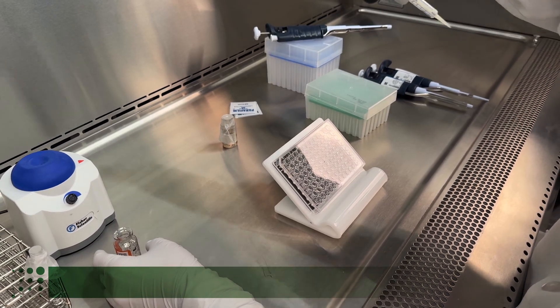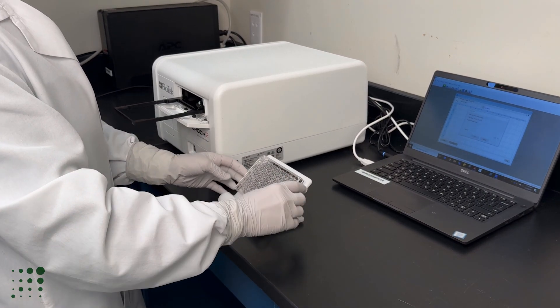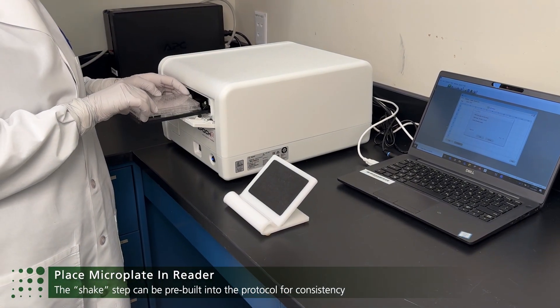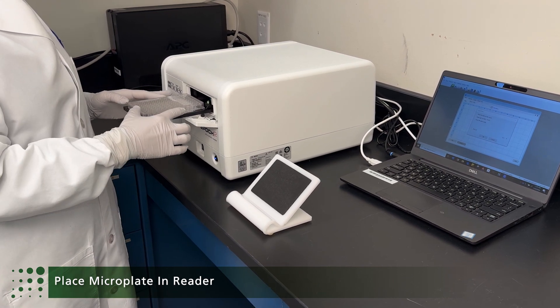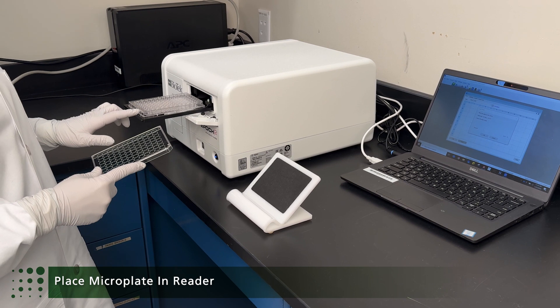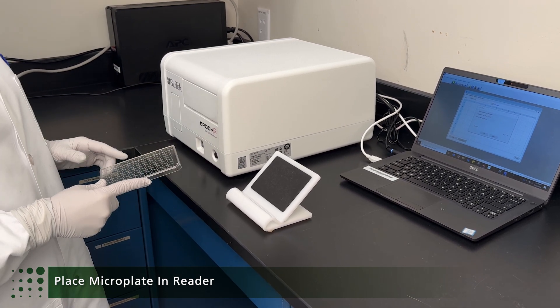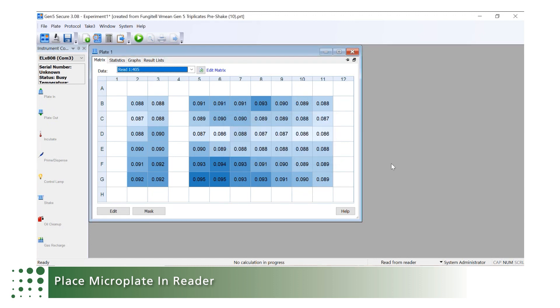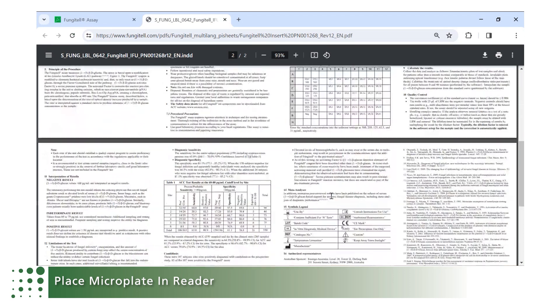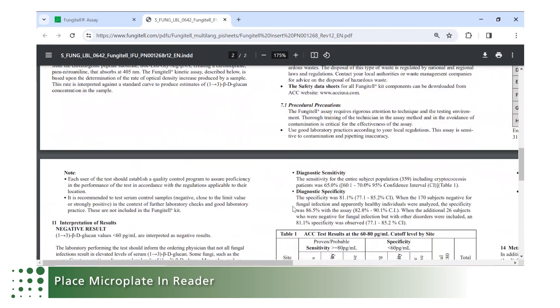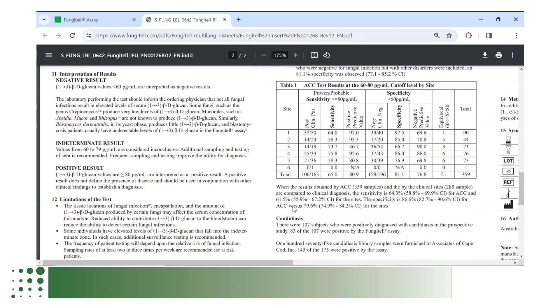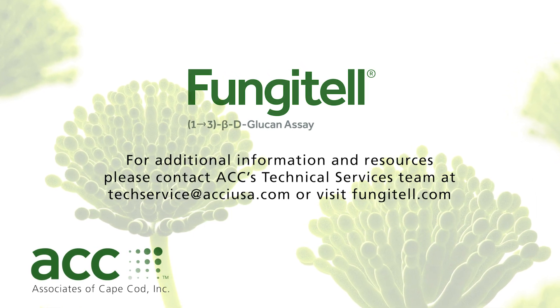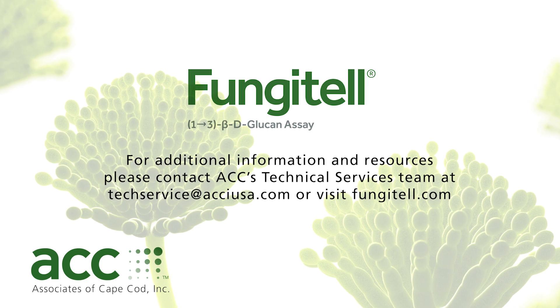Replace the microplate lid and move to the reader. Insert the microplate, carefully remove the lid, and ensure that the plate reader shakes the plate for 5 to 10 seconds. Read the microplate with the lid removed for 40 minutes at 37°C. Once the assay is complete, there are options to review the results, print a report, or export to LIMS. Guidance for result interpretation and quality control criteria for assay and sample are listed in the instructions for use. For additional information and resources, please contact ACC's technical services team or visit fungitel.com.